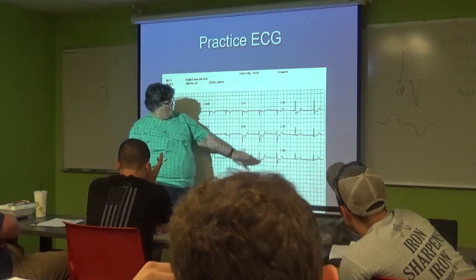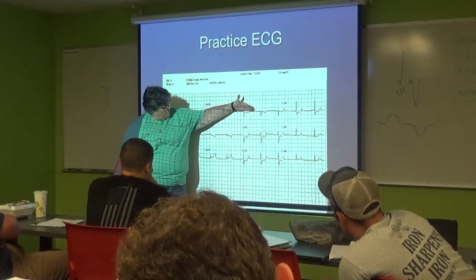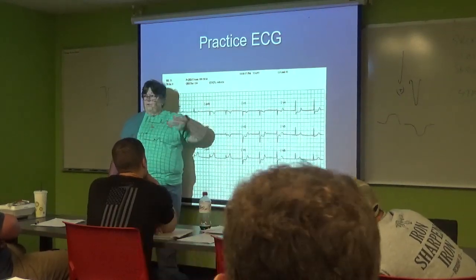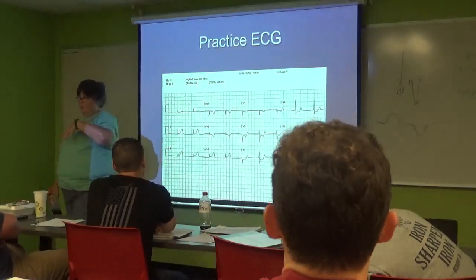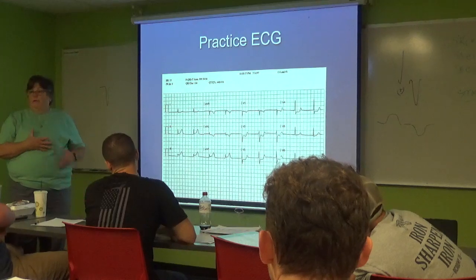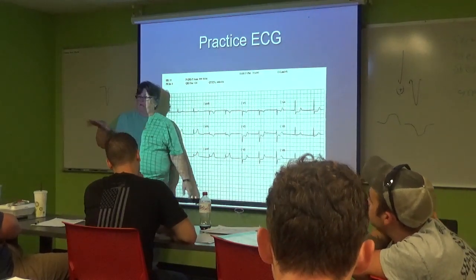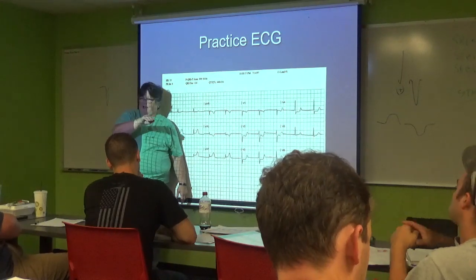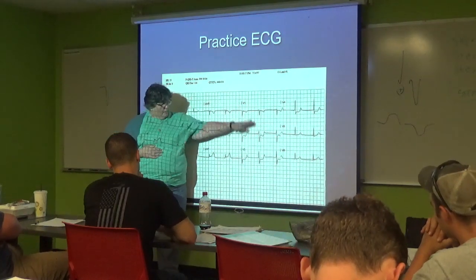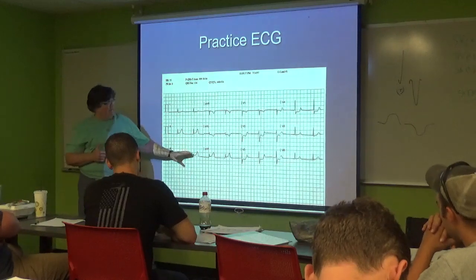Okay, let's do our 5 and 6. Those are normal. Okay. Septal. V1, maybe some depression there. V2, we got depression definitely there. You see the depression all the way through. You're having depression throughout this whole area. So where will the elevation be? So what's in your inferior? Right, so we have an inferior wall with posterior involvement. If you were to put that all on, you would have inferior elevation and posterior elevation. These are all connected from one RCA. So this is an inferior MI with posterior involvement, because I got depression in the front, which means I got elevation in the back. So the main MI is an inferior with posterior involvement.